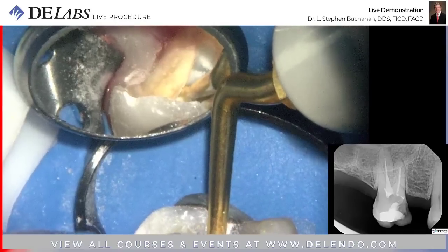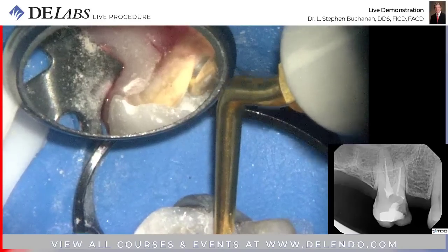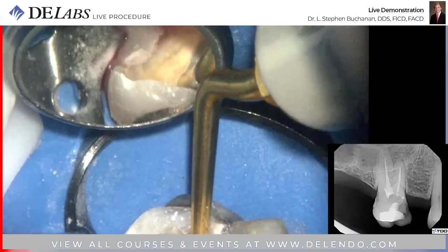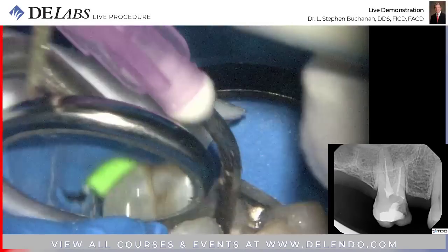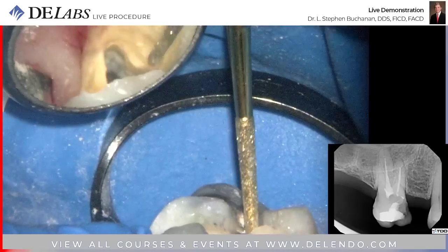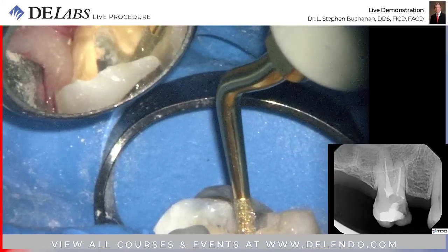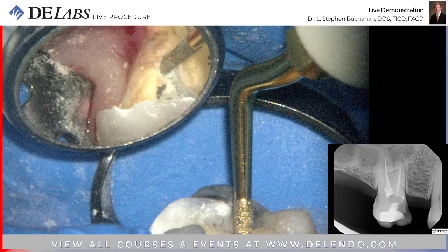I'm not cutting apically, I'm cutting laterally. Does that instrument have lateral diameter? It doesn't. It could use them. Next gen. Yeah, actually I thought it was going to be better without them, but it would have helped. Okay, here's the MB1. We just start taking that back.